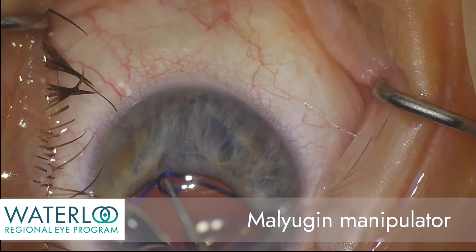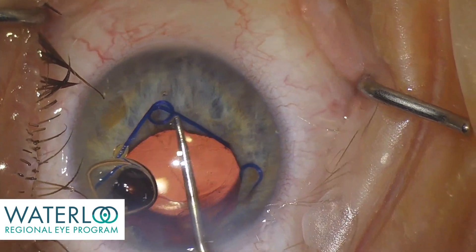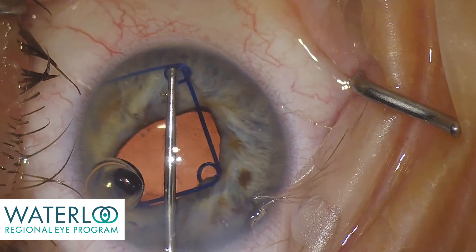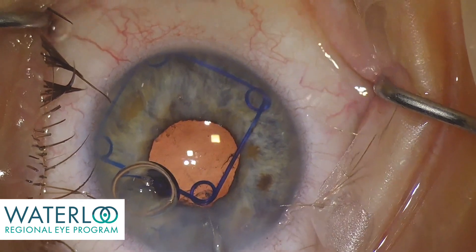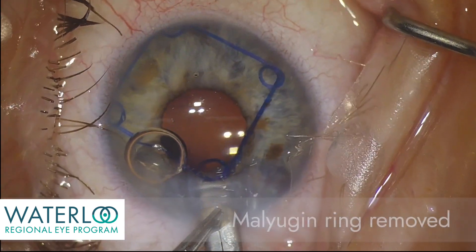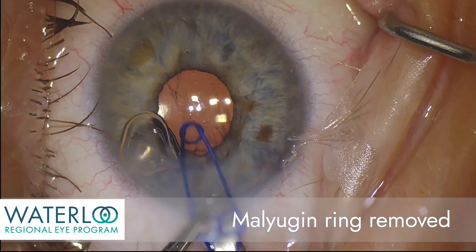A malyugan manipulator is now used to gently unhook the eyelets from the iris. The malyugan ring is rotated as each eyelet is unhooked. Viscoelastic is in the anterior chamber to protect the cornea. The malyugan ring is then re-engaged through the malyugan inserter and removed from the eye.